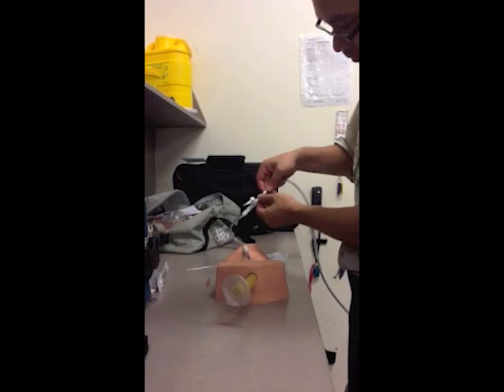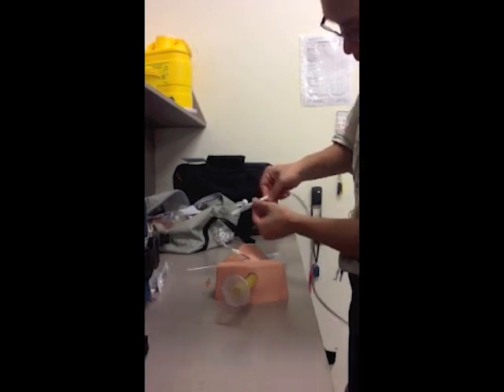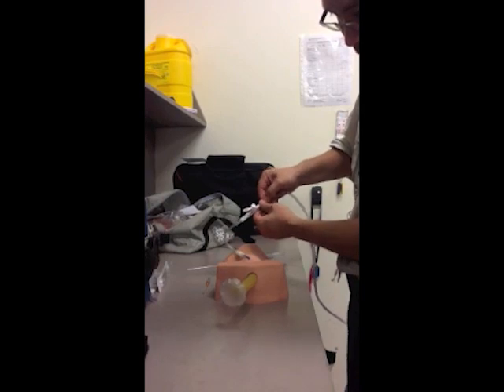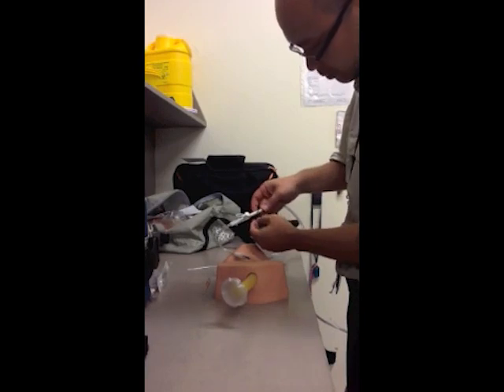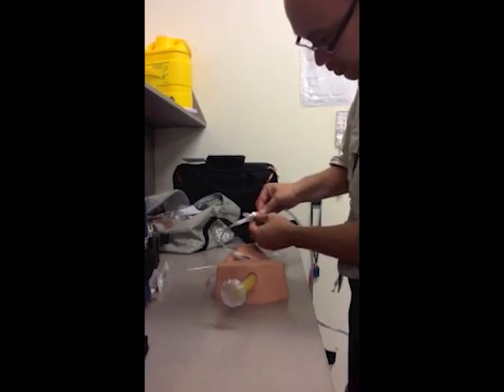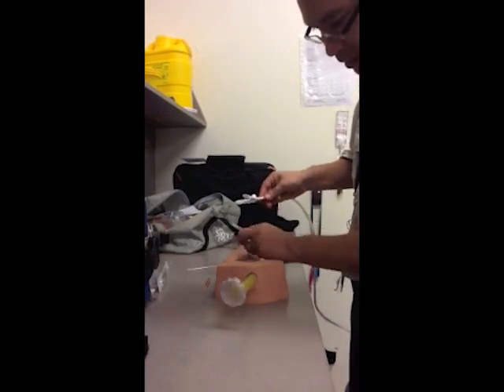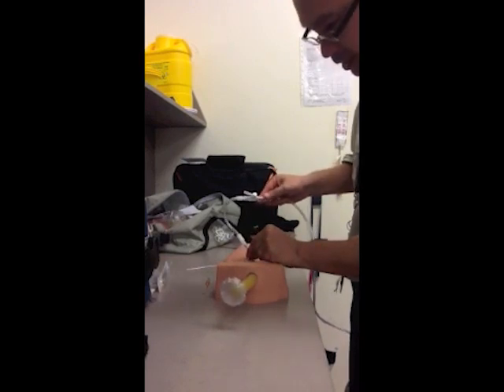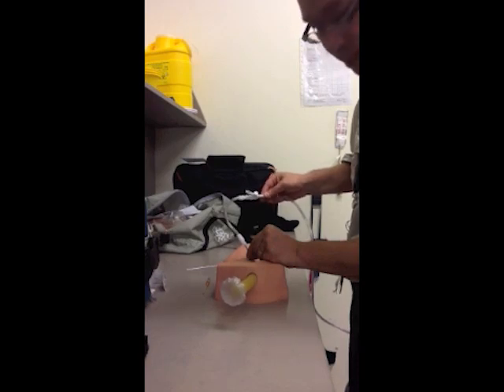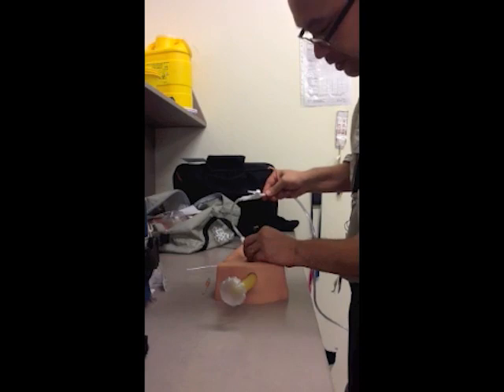Just a little bit of flow by occluding these holes. It's a little bit less precise than a three-way tap, but you can do it with one hand — it's just not as easy. The catheter, though, is quite robust: very resistant to kinking and has a much better length than the standard intravenous catheter. So that's the technique.